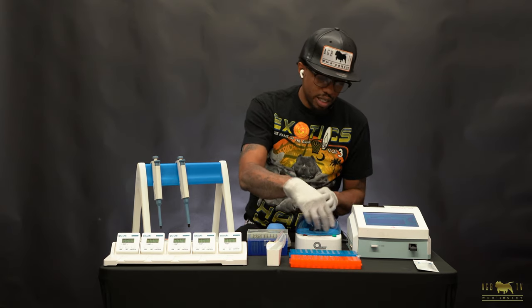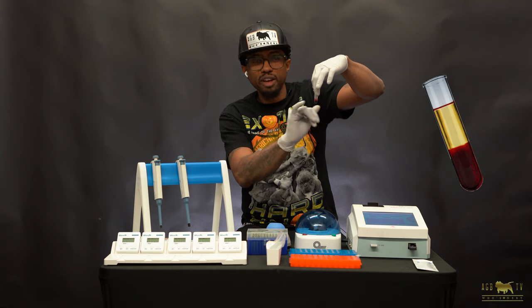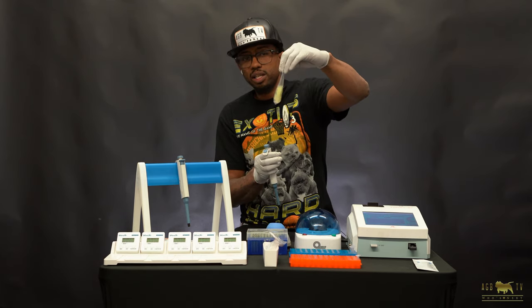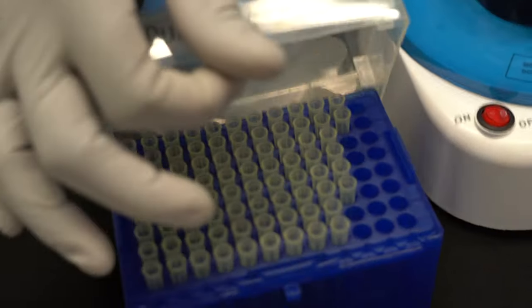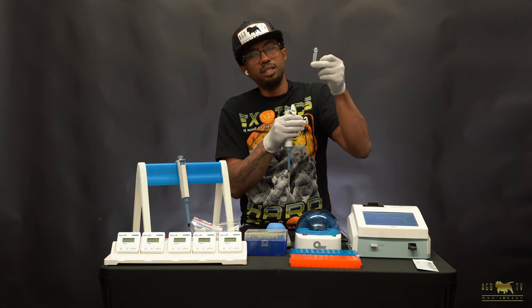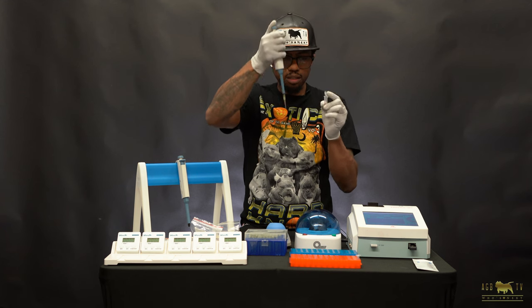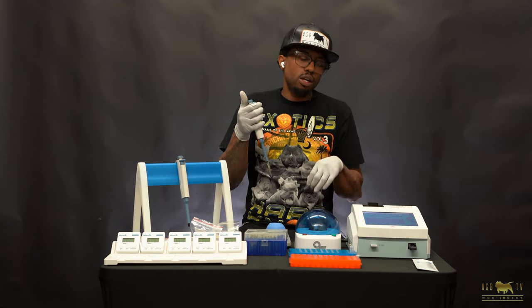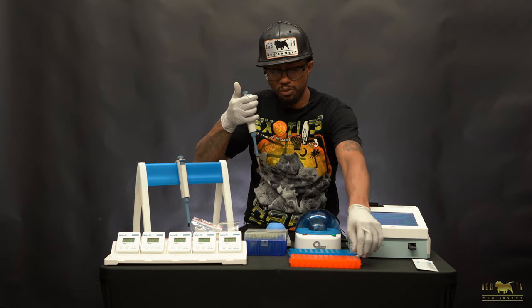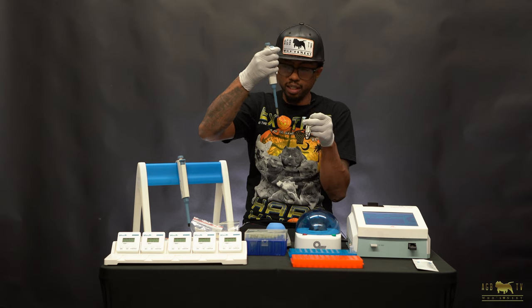Now that my blood is done being spun down, I'm going to take it out. Sometimes it gets a little cloudy or still looks red, but for the most part it will come out very clear. I'm going to take my 75 UL pipette and grab a pipette tip. Sometimes when it's hard to see the clear part, I'll hold it up to the light to make sure I get a clean pull — you don't want any blood in there. The pipette has two clicks. Go down to the first click to pull up the plasma, then let it draw up the 75 ULs. Take the buffer, push the serum into it all the way down to the first click, then down to the second click, and you can get rid of the tip.